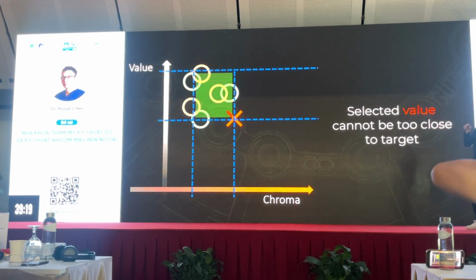If I choose A1 for the shade tab, I don't want to choose A1 for the ceramic, because if I use the A1 ceramic and I mill it, it's going to be thinner, it's going to be affected by the stump color, and the actual translucency of itself is going to make everything dark. So you've made the wrong choice.